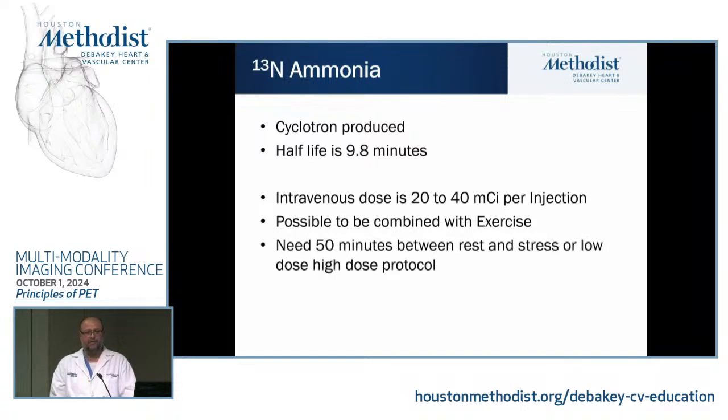And to be able to acquire good images, you need to wait until the first dose decays, and then you go ahead and inject the second one. But now, with the advent of digital systems, you can inject with low-dose, high-dose protocols, so that delay is only needed if you have an old system.